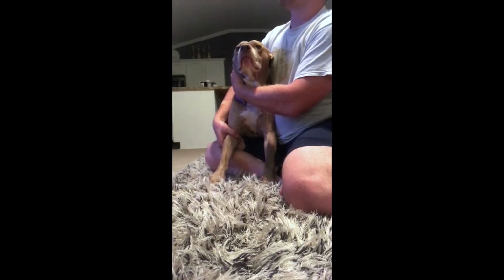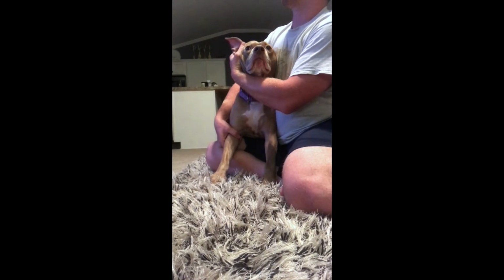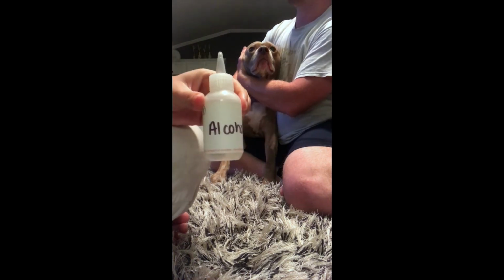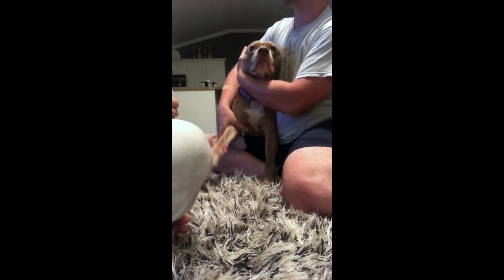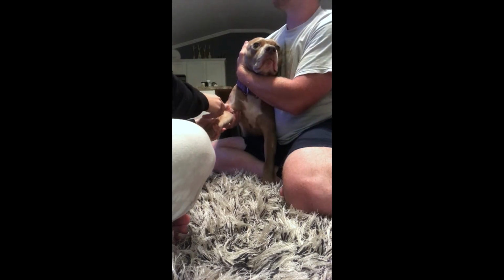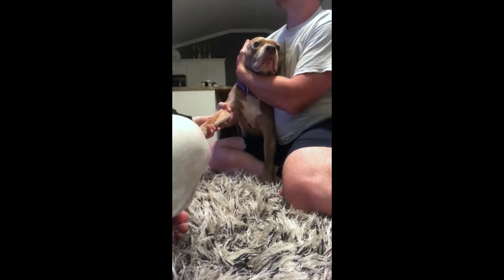Now I'm going to demonstrate how to do a cephalic blood draw on a canine. So my assistant has the patient here restraining her head against his body. We have our alcohol here. I'm going to grab her arm. He's going to go ahead and occlude the vein. I place some alcohol over the vein.